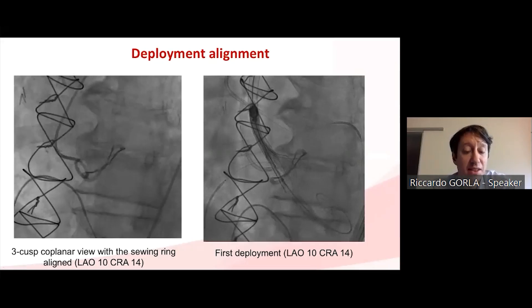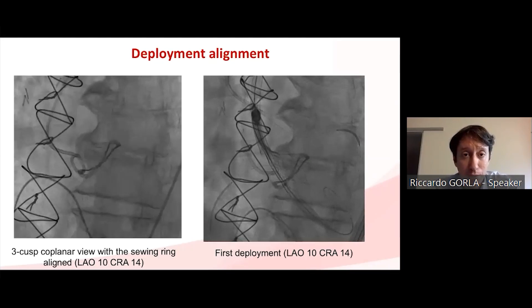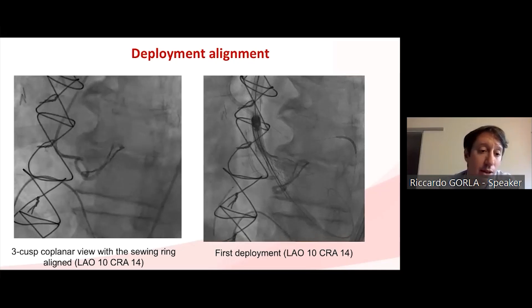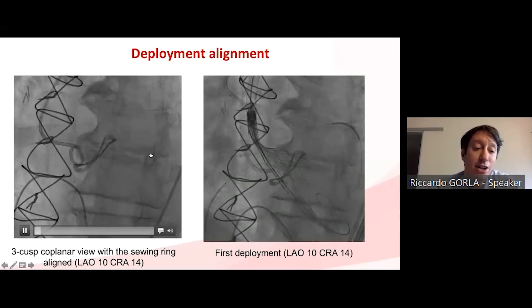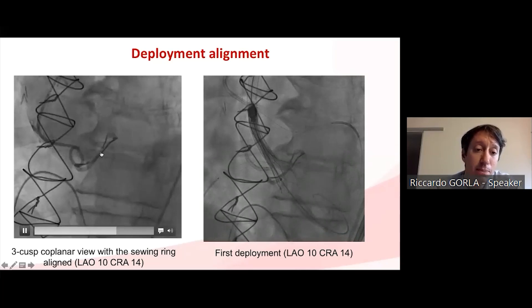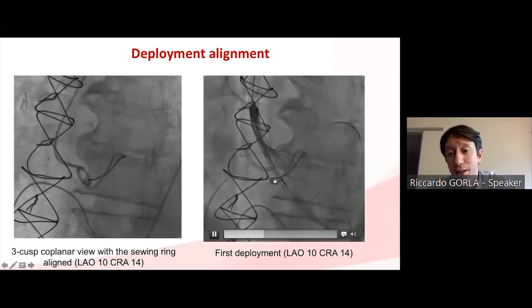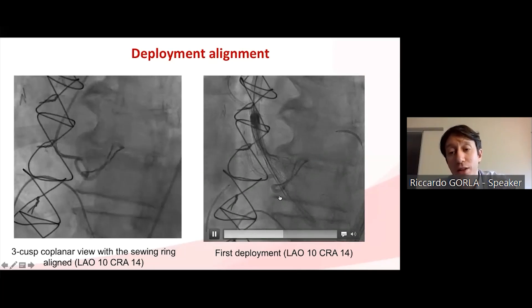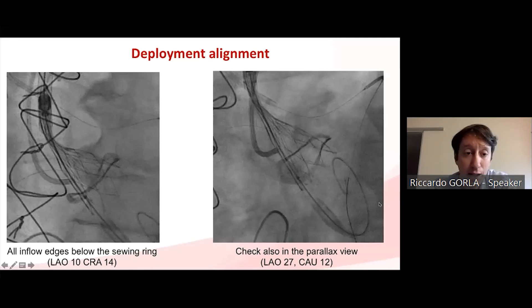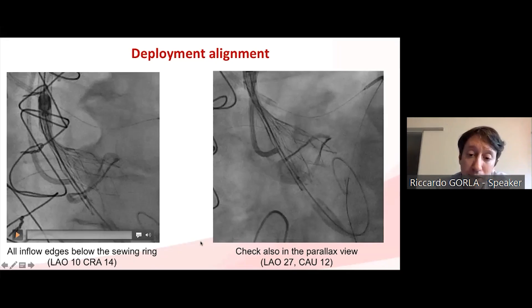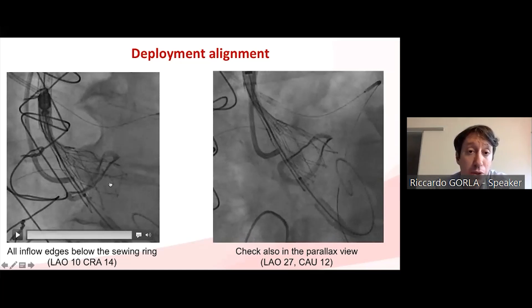Here is how we perform implantation at our institution. This is an example of a Mitraflow 21mm. With this device, the sewing ring marker is the lowest portion of the valve. You start from a tri-cusp coplanar view, adjust your projection to keep the sewing ring aligned, and then begin implantation. With the Portico, you complete the first phase of release in this projection.